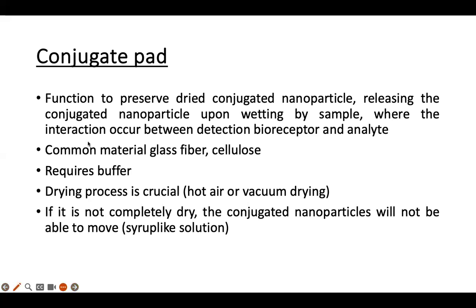Okay, the conjugate pad functions to preserve dried conjugated nanoparticles conjugated with antibody. In this case, it releases the conjugated nanoparticles upon wetting by the sample. So when the sample from the sample pad moves to the conjugate pad, it should be able to move together once they have interacted. Okay, it should be able to move.